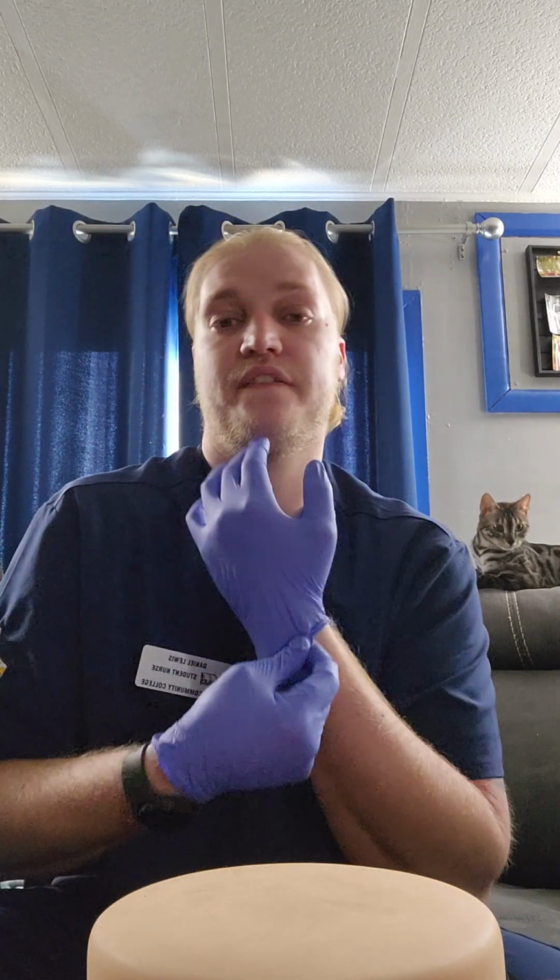All right, and then at this time, I'm going to ask the patient if he has any allergies or anything like that. He tells me no, and then I'm going to verify that it is, again, the correct time, dose, and medication for this patient. So now that we have the patient sitting down, I'm going to take an alcohol wipe and clean the area that I'm going to be doing the intradermal injection on, using a small circle, starting in the middle and working my way out. And then I'm going to allow that to dry.